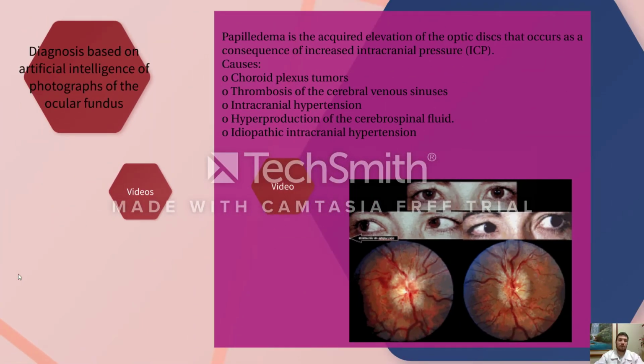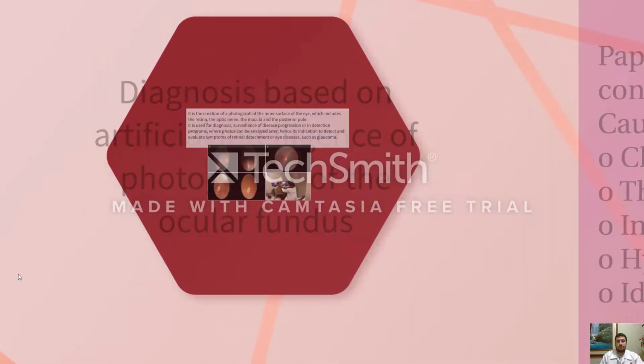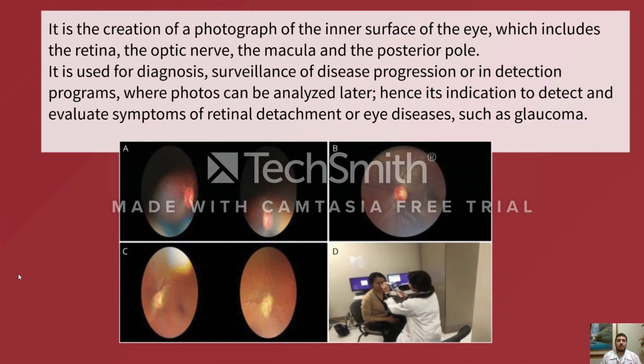Diagnosis based on artificial intelligence of photograph of the ocular fundus. It is the photograph of the inner surface of the eye, which includes the retina, the optic nerve, the macula, and the posterior pole.